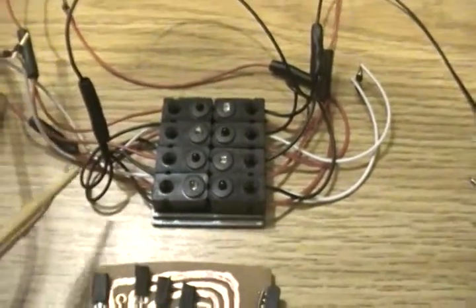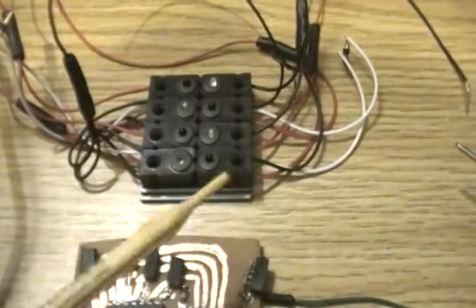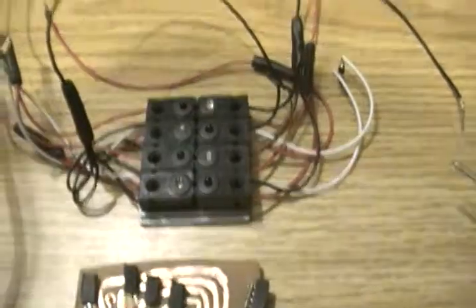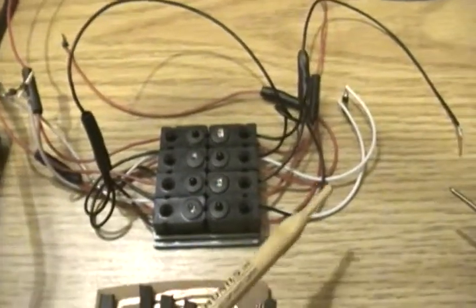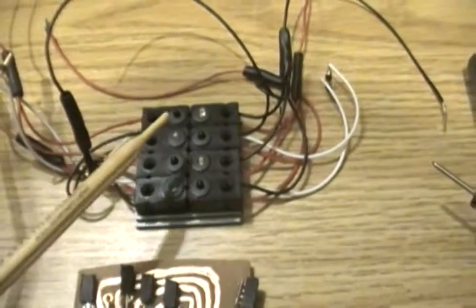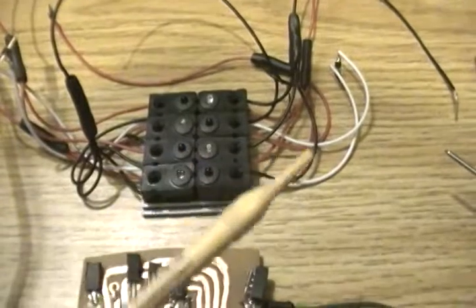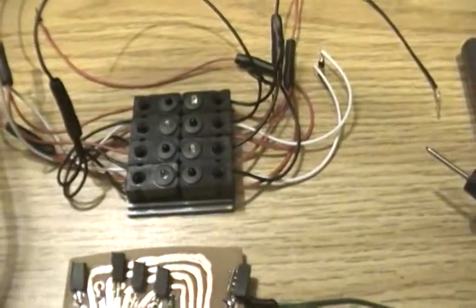The black wires, which are the ground, are all connected together, 4 from here and 4 from here into one wire. And then you get the four wires, 1, 2, 3, 4, which are white, one for each photodetector. Each photodetector has one white wire, and I'll show you where they go.